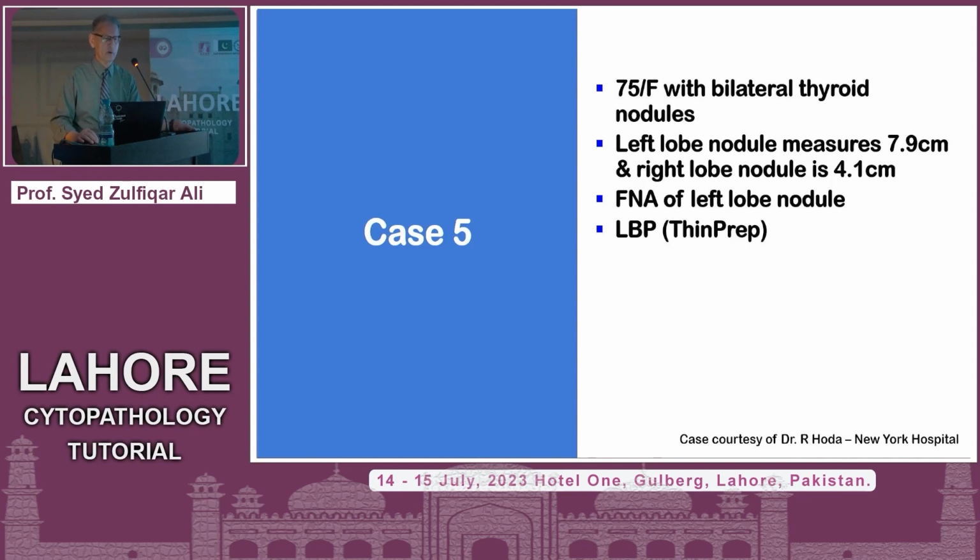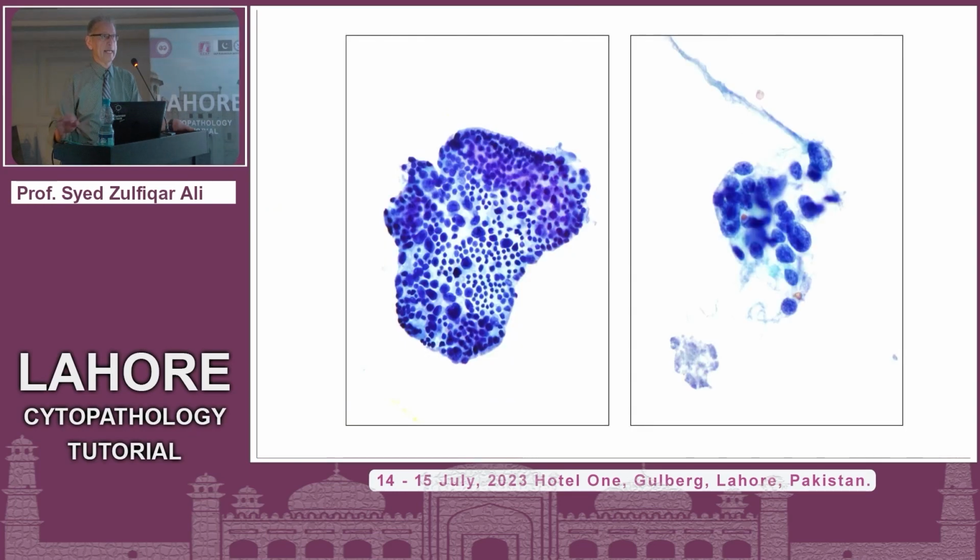It's a 75-year-old female with bilateral thyroid nodules. And I'm showing you the FNA from the left lobe, which is 7.9 centimeters. So this is liquid-based, ThinPrep on this case.